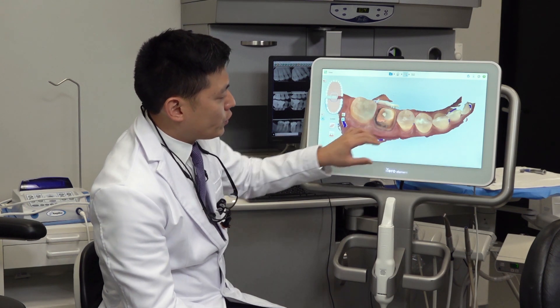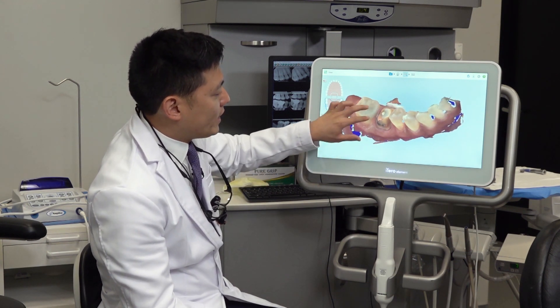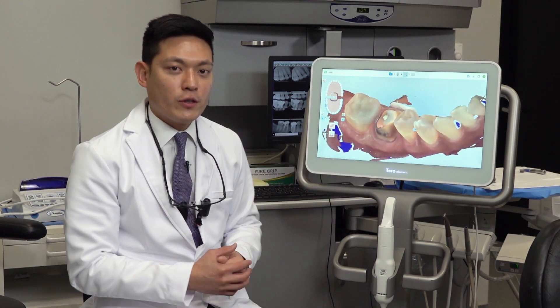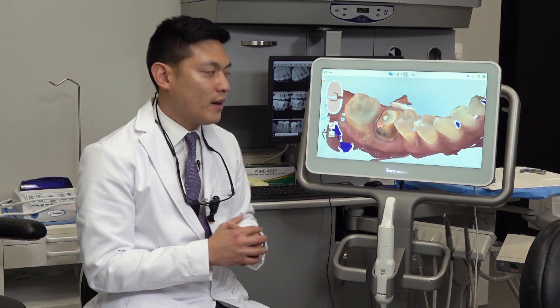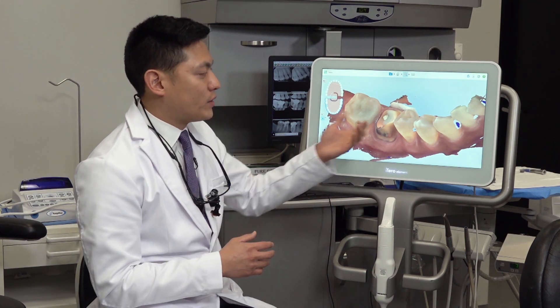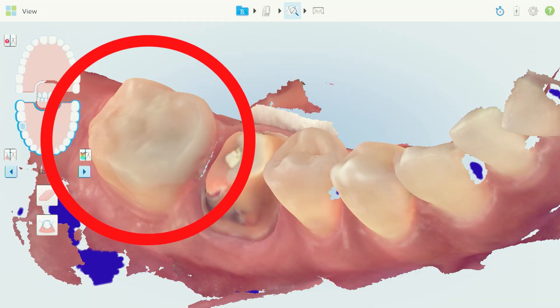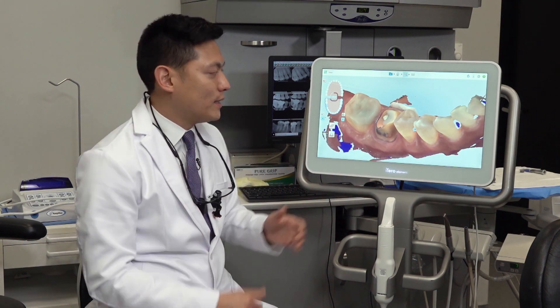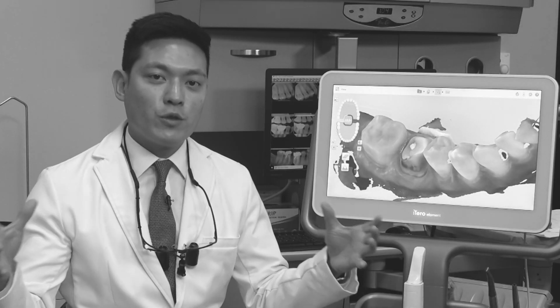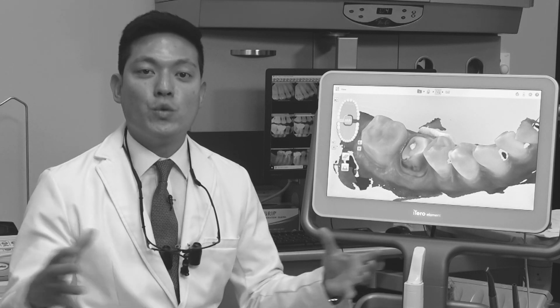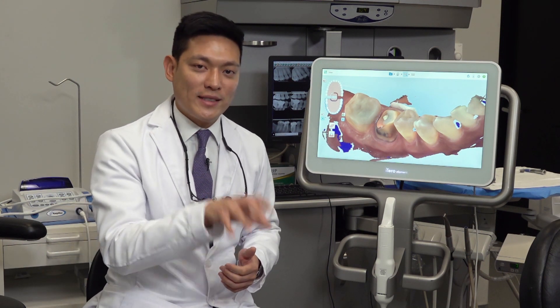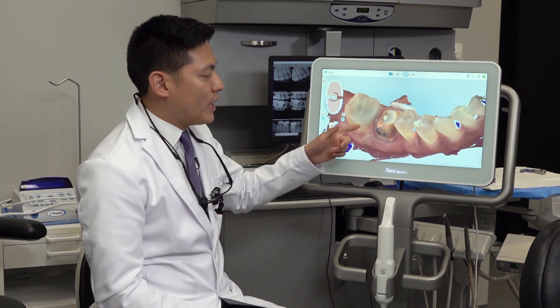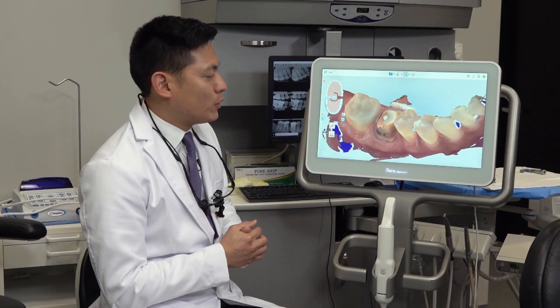Now those surfaces are certainly critical, but an area we can't ignore will be the contact surfaces over the adjacent teeth. In this case, number 29 and 31 — those contact surfaces next to the prep also have to be filled in. If those are missing, the restoration is most likely going to be too wide mesial-distally, and that would mean a lot more adjustments on your end when you're going to try to seat it on the patient. So making sure that's filled in will be critical.